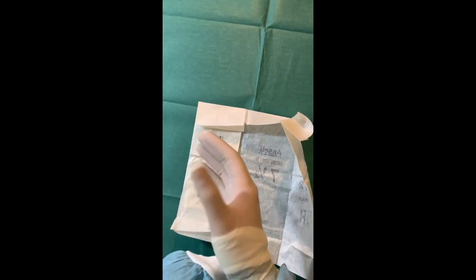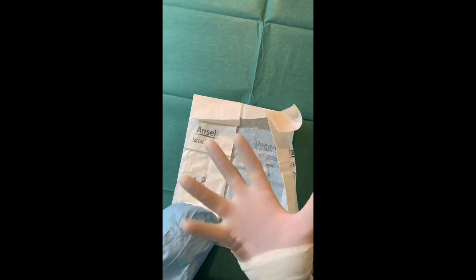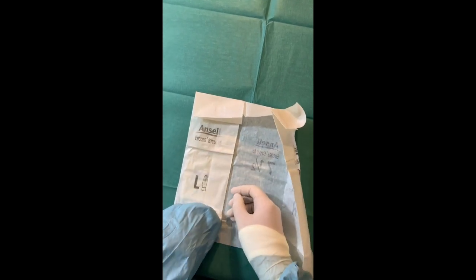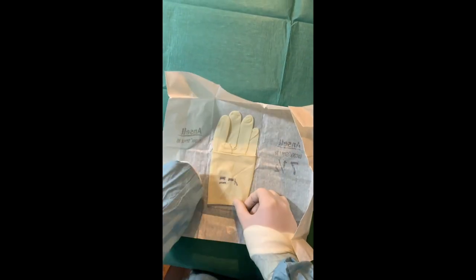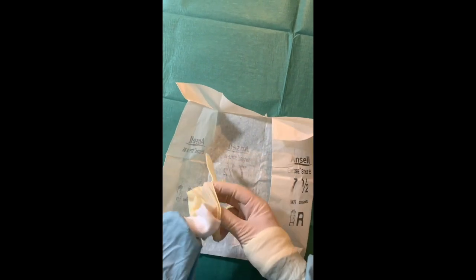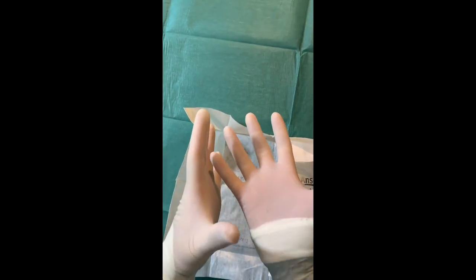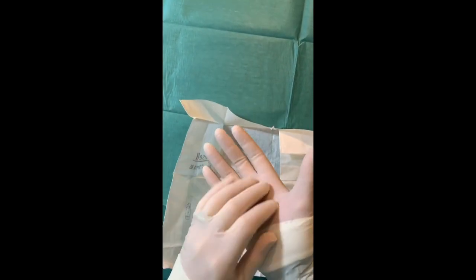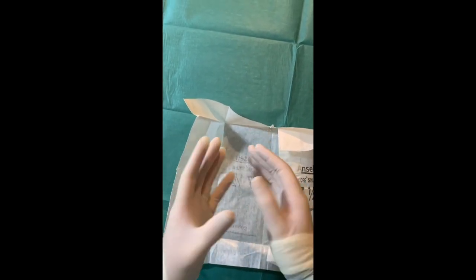We pull the glove all the way over the cuff and then repeat this process. This hand is now sterile, so it makes things a little easier. Keeping our fingers inside, we can remove, place our hand through the cuff, and then push your hand forward and in. This way our fingers haven't touched the outside of the glove at all, and that maintains the sterility.